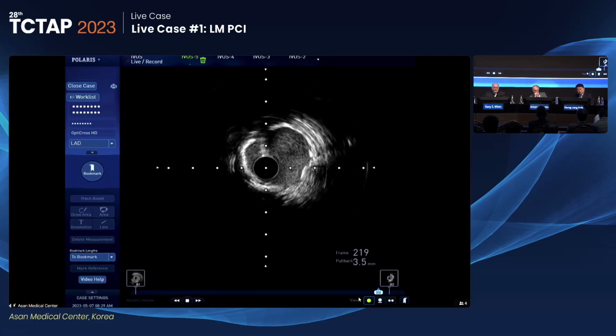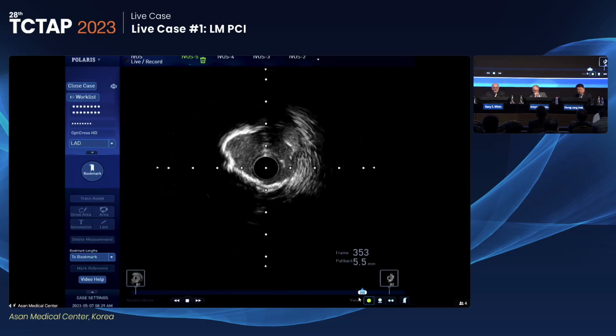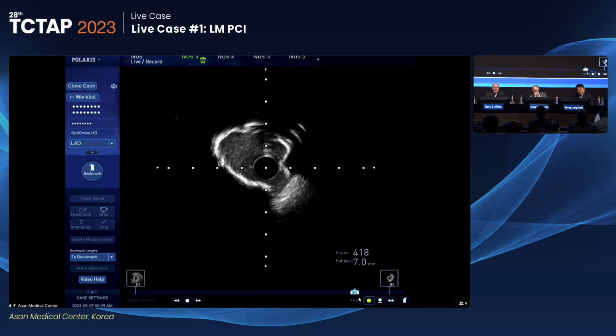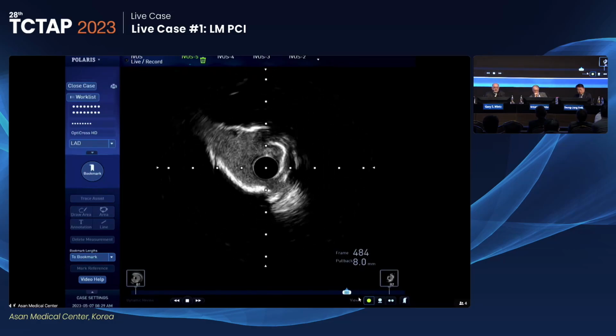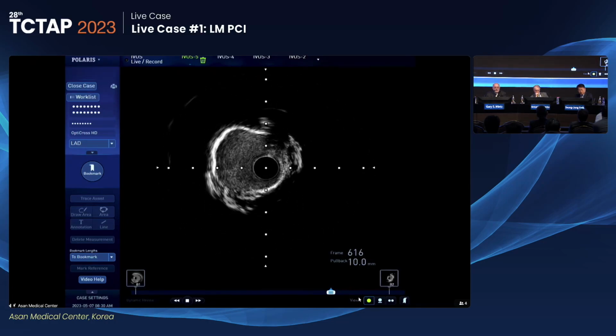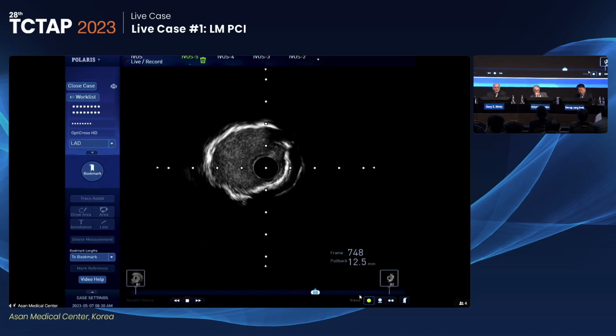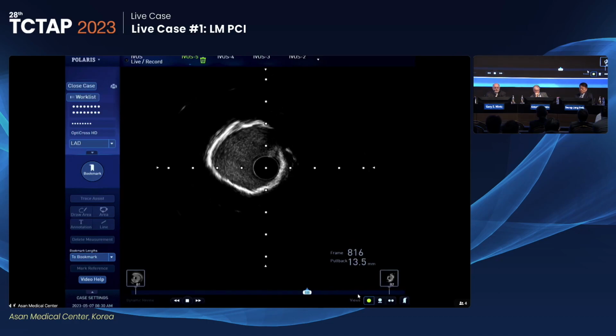Again, this is the freshly placed stent. At this point, it's well expanded. You obviously want to do measurements. You look at the edge, and it looks okay. You see a lot of calcium, but it's not a solid 360 of calcium, even though it may add up to it. There are multiple arcs that overlap, so they can be spread apart.